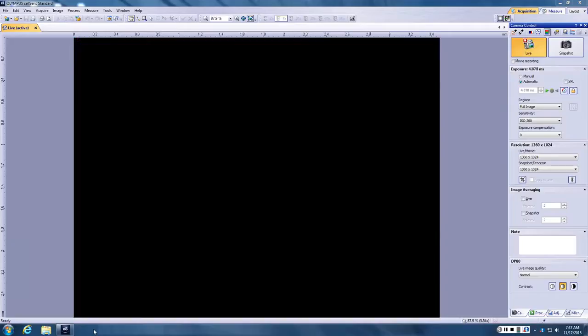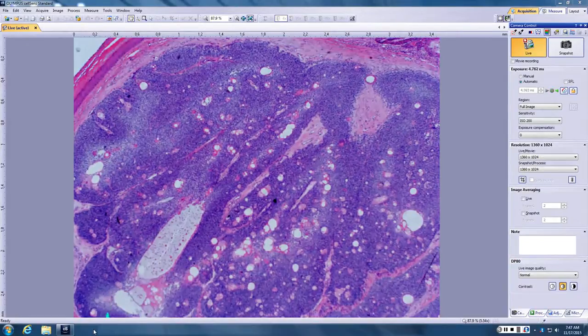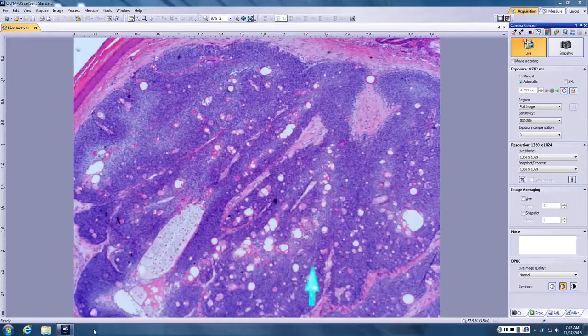Okay, Rob. Looks like we got a well circumscribed dermal nodule. Look at it up on the screen. I think it's even easier up on the screen. It's darker. What color is the nodule? So it's like dark bluish purple. Blue, right? So it's a blue nodule. And then what are all the red round things? Probably ducts, right? Okay. So what is blue with red ducts?